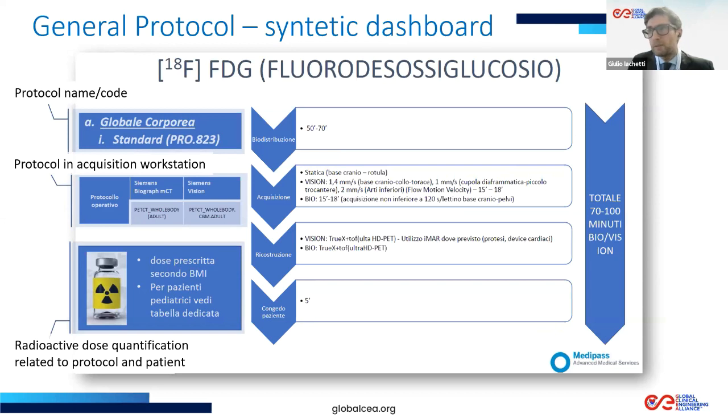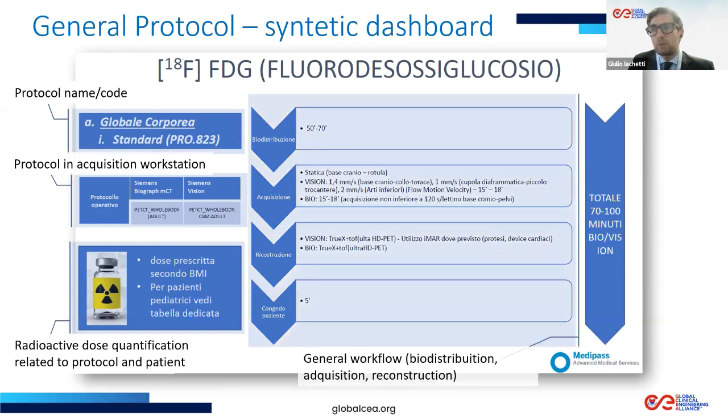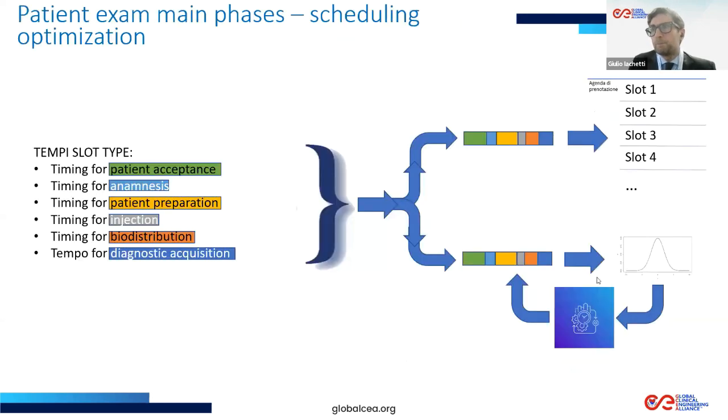There are different methods, and the general workflow. Again, we have biodistribution, acquisition, reconstruction, and the time. We always consider the time to close the exam for the patient for a total time of the slot. Okay. We spoke about parametric scheduling. Just an insight about it.